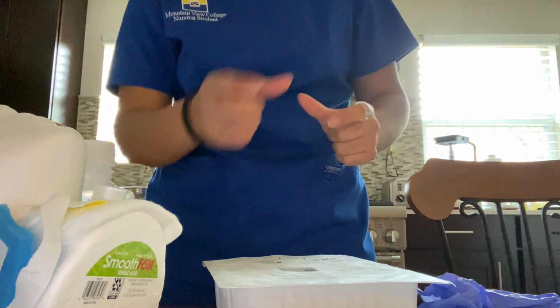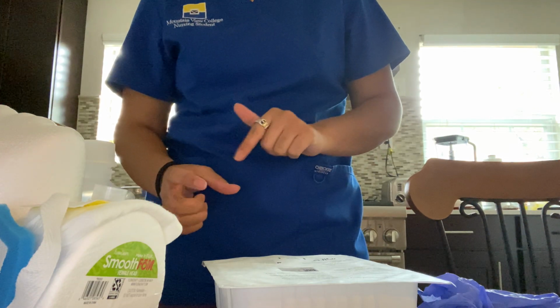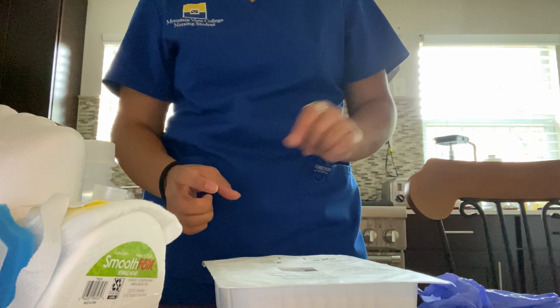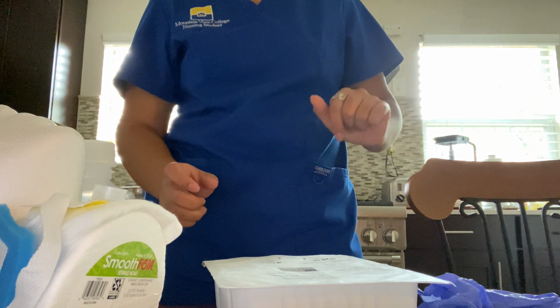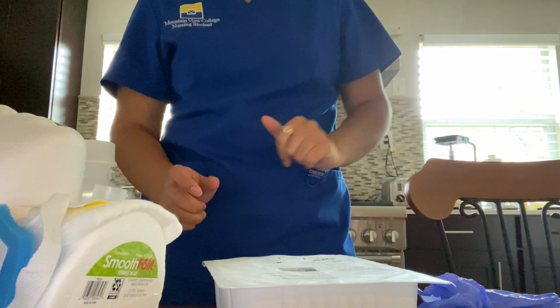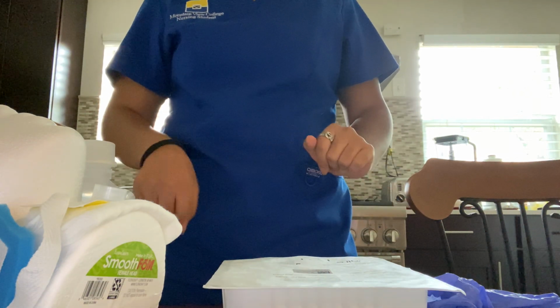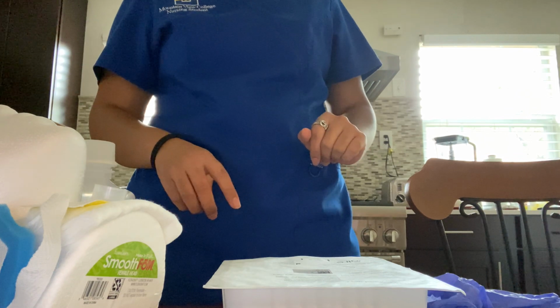You're not going to touch the inside of the cup, because you're going to put the saline in there. So you're just going to pour that in there, and I'll keep maintaining my sterile technique, and that little cup will be open with my saline in there.